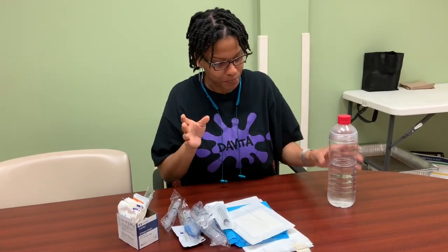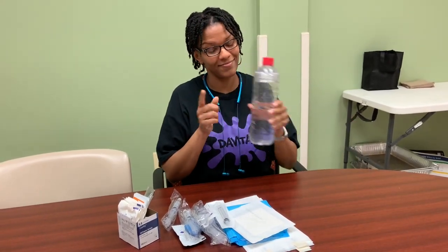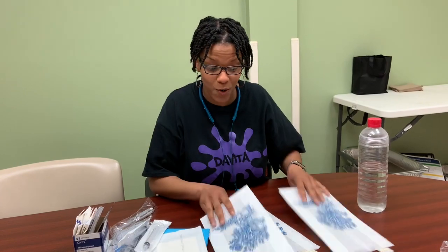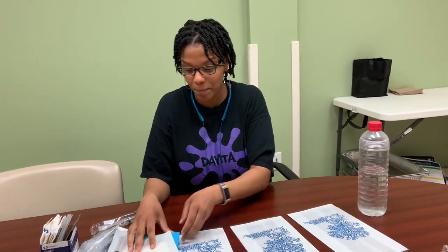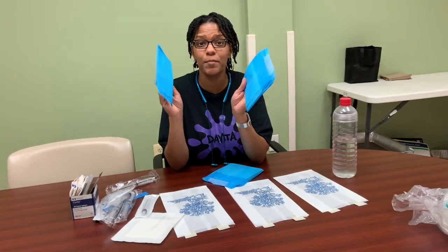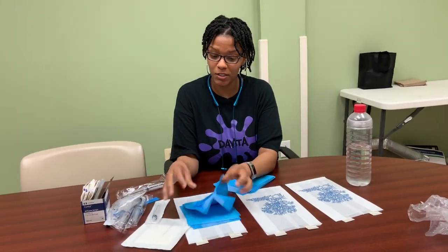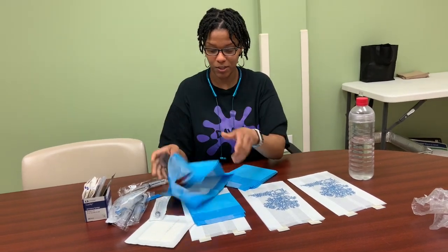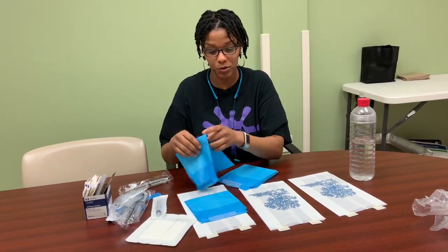I've heard that it's a luxury here that we have bags, because a lot of clinics don't have bags, so I'm happy about that. Then we have chucks — each patient each time gets two chucks. Chucks basically look like this; they're little rectangles. We put those down under the patient's arms to catch blood or anything that happens.